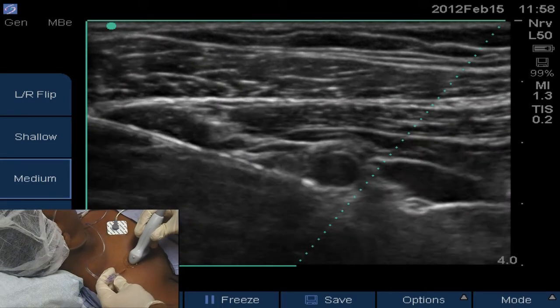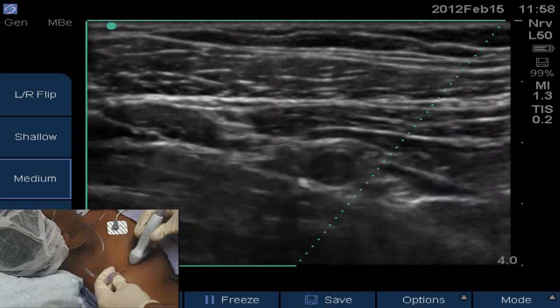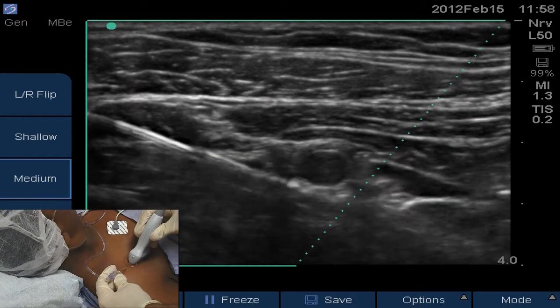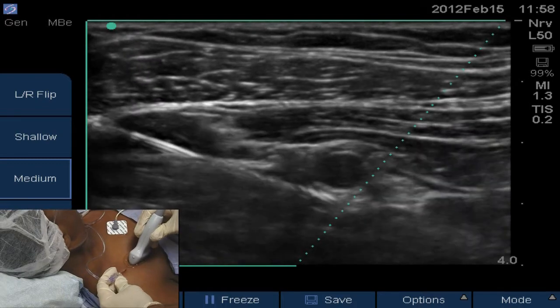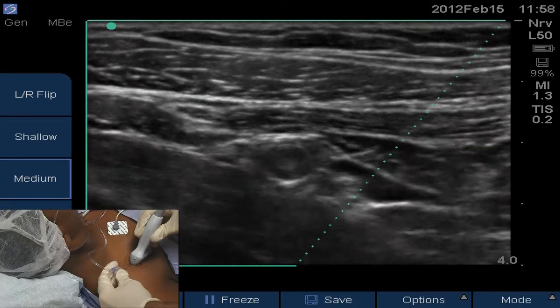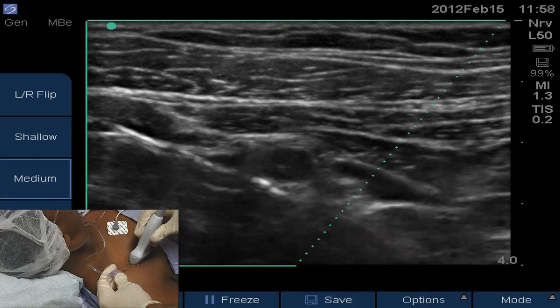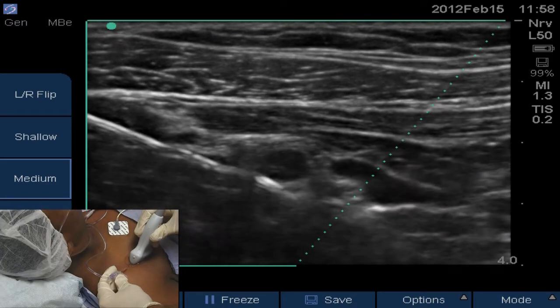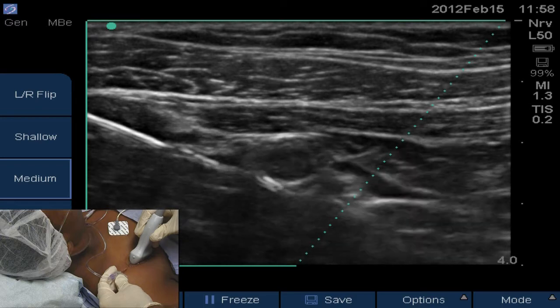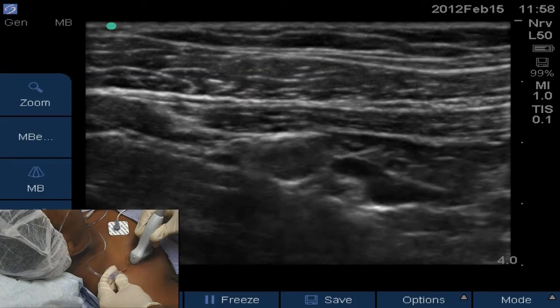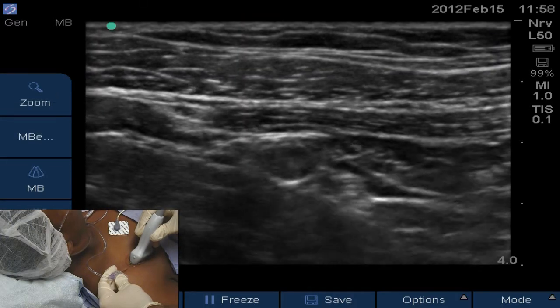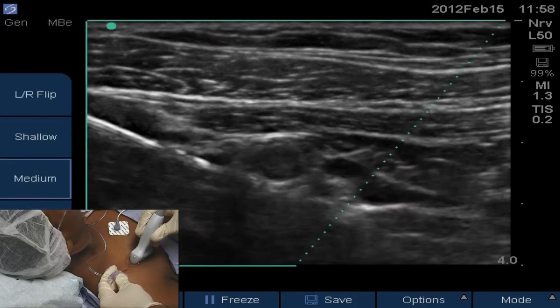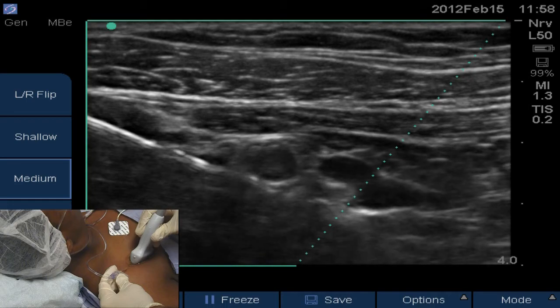I'm going to get the needle tip, trying to get it around six o'clock relative to the artery. It looks like about 45 degrees gets you a nice view of that needle along its length. Go ahead and turn the needle visualization software off — needle essentially disappears. Turn the software back on — needle reappears nicely.